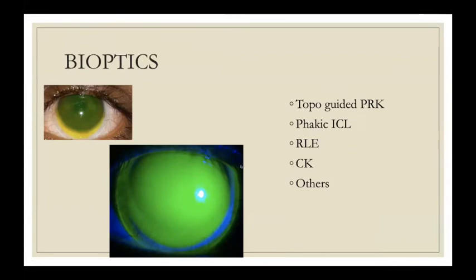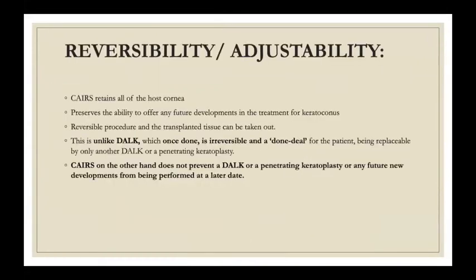Bioptics, you could combine any of these, topo-guided PRK, phakic IOL, refractive lens exchange, conductive keratoplasty, or any of these with CAIRS. And so you can improve the effect further. It's reversible and adjustable, as I said.